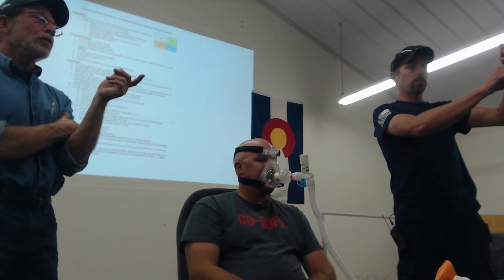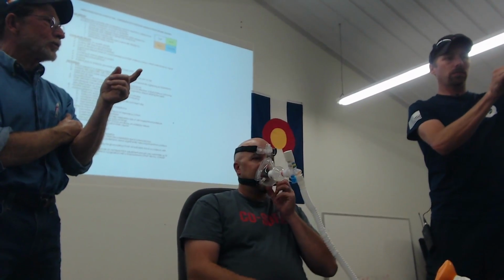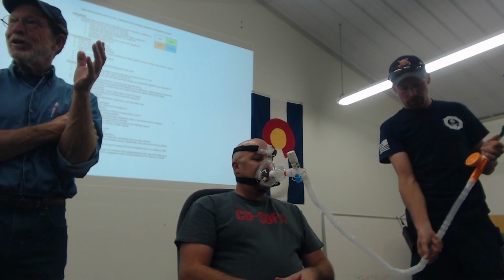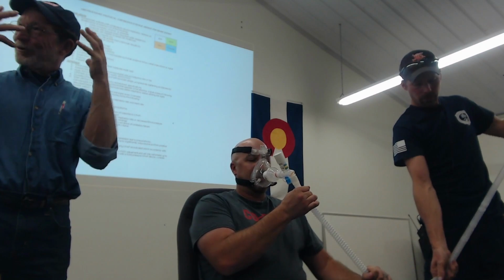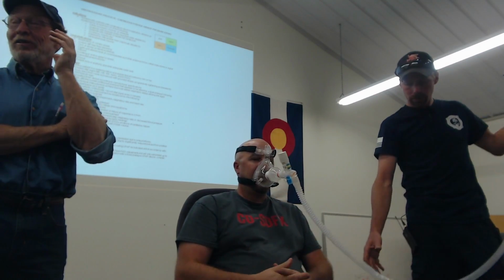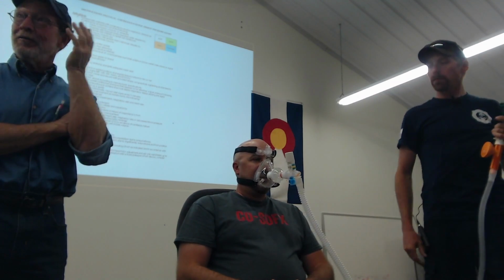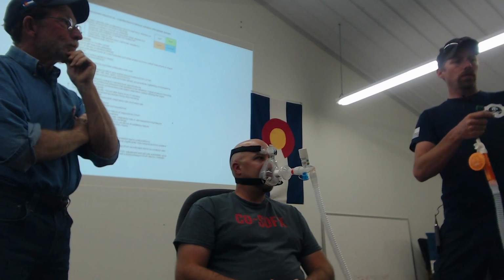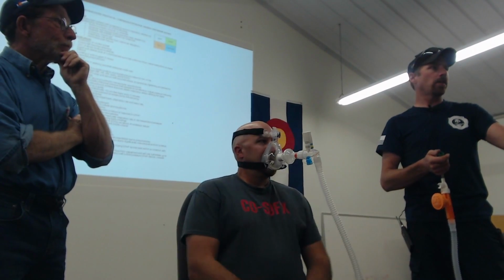And actually, even though it's a really noisy unit, and maybe we'll turn it on for a minute so that we can hear it, in a strange way, I think that's even kind of therapeutic because they can feel how much air is moving around here, and psychologically, it's like, gosh, we're getting a lot of air. And if you're air hungry, that is a good feeling. So, yeah, let's see what that looks like. So, normal procedure here. Put your regulator on your bottle.